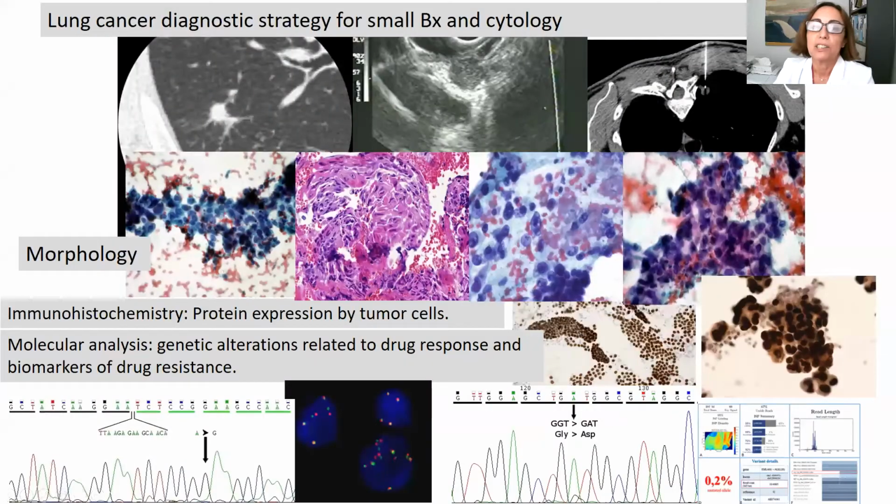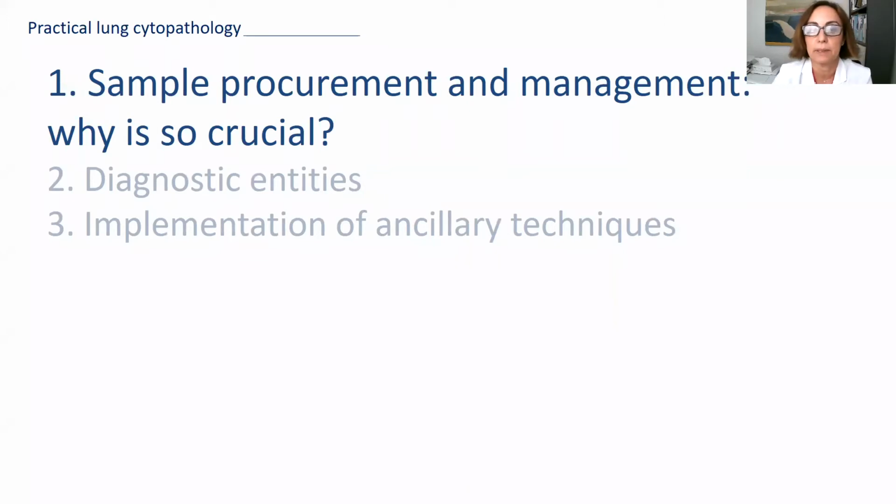So, starting my talk, we know as cytopathologists that there is a strategy for diagnosing non-small cell lung cancer and small cell, of course, in small biopsies and in cytology. First of all is morphology and smears, cell block, whatever type of cytological preparation. Sometimes we need the help of immunohistochemistry, and nowadays we for sure have to use some studies to inform the clinician about biomarkers. So let's start with point number one.